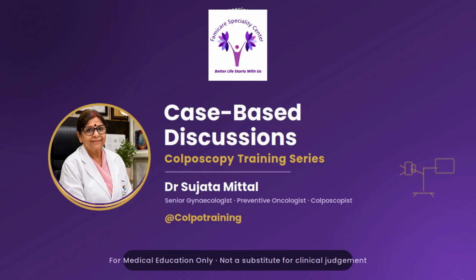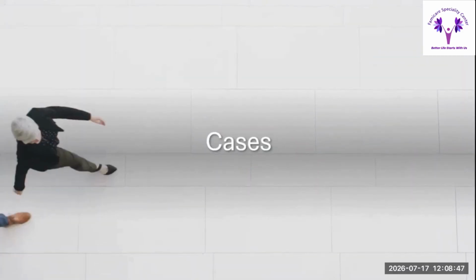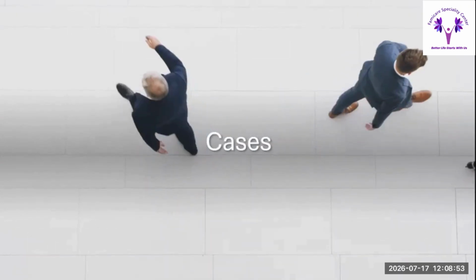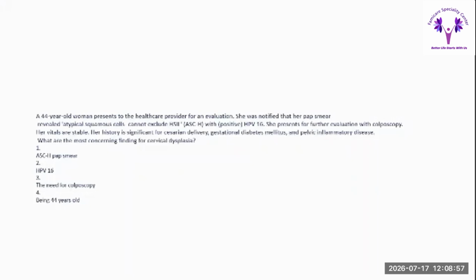So in our colposcopy series, I am putting up some of my cases for your learning. We will be starting cases and I'll be telling you about the SWEDE score, how to identify the lesion, although there might not be any lesion in these cases. So first of all, a quiz.